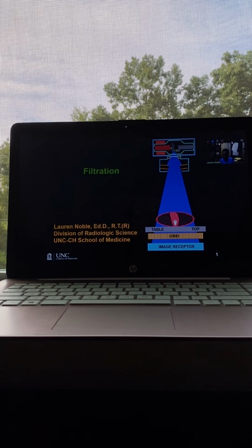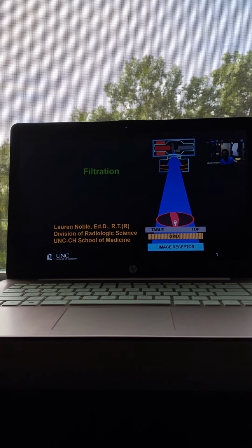It's made of molybdenum. So it's a thick layer of molybdenum. But molybdenum is used as the backing because it does have a high thermal capacity, and it's lighter weight than tungsten. I don't know if you remember how heavy those anodes were, but they do have some weight to them. They'd be even heavier if they were fully composed of tungsten.